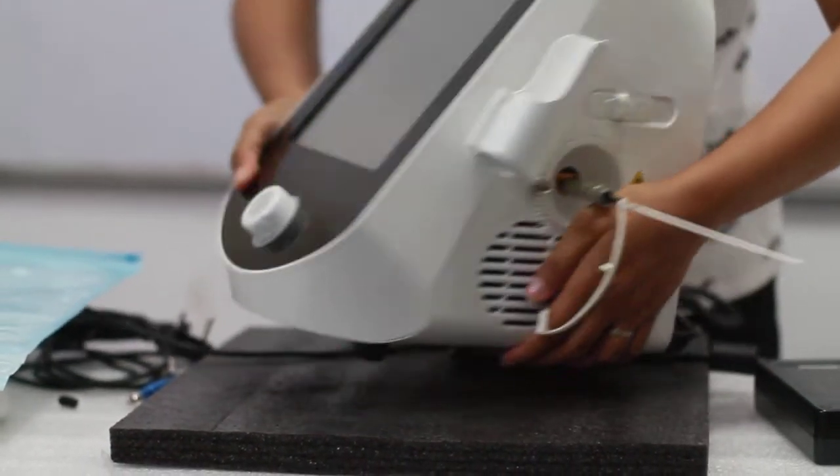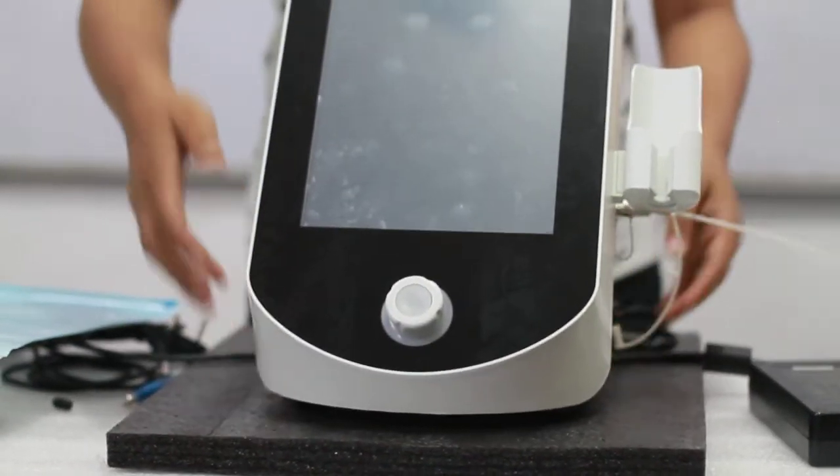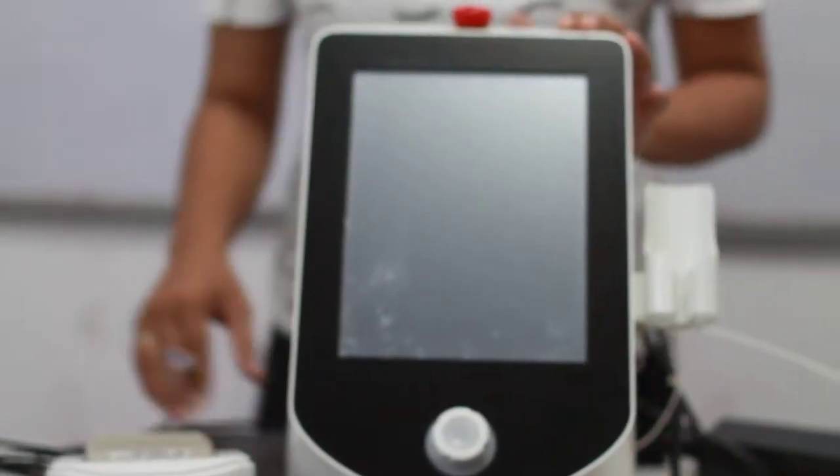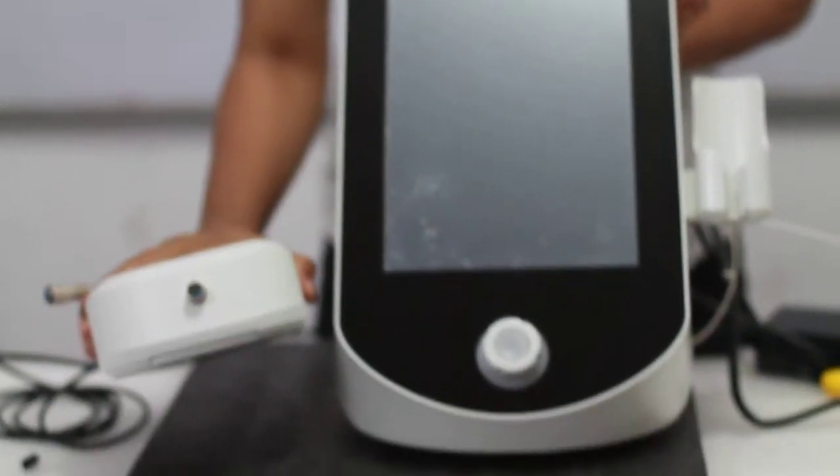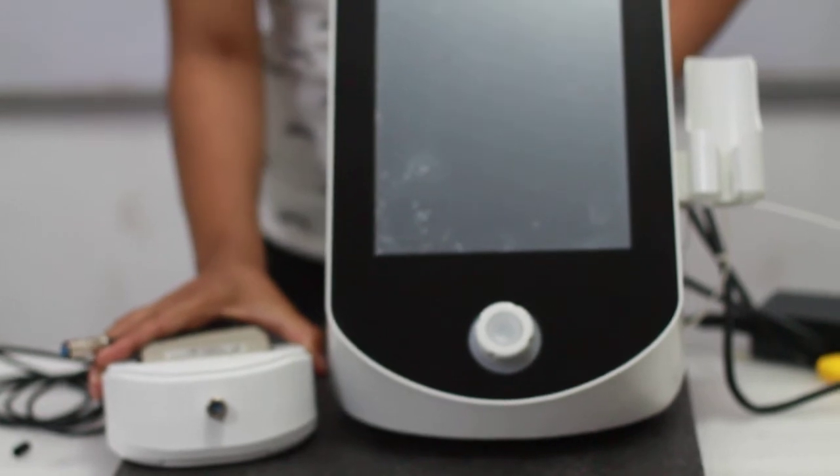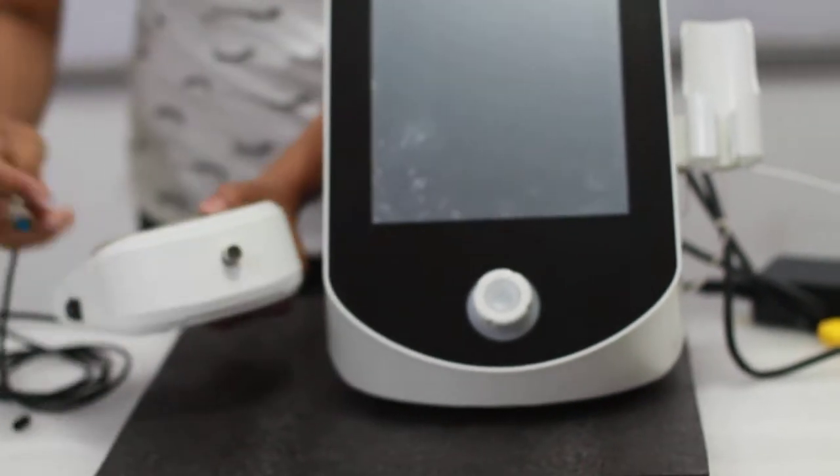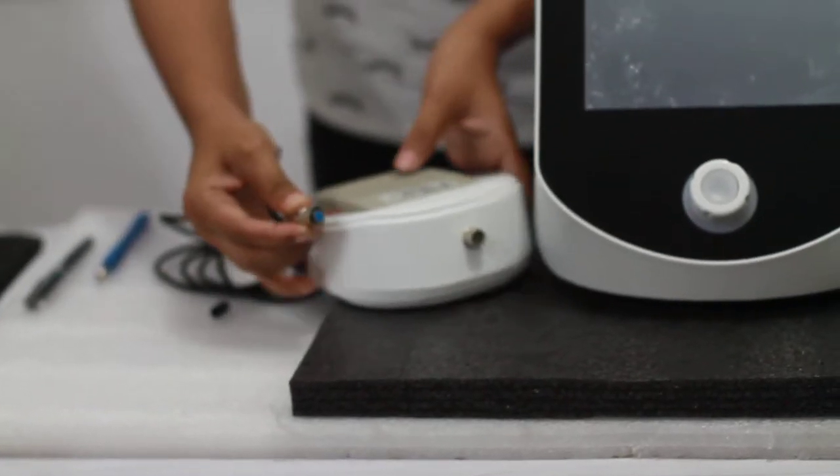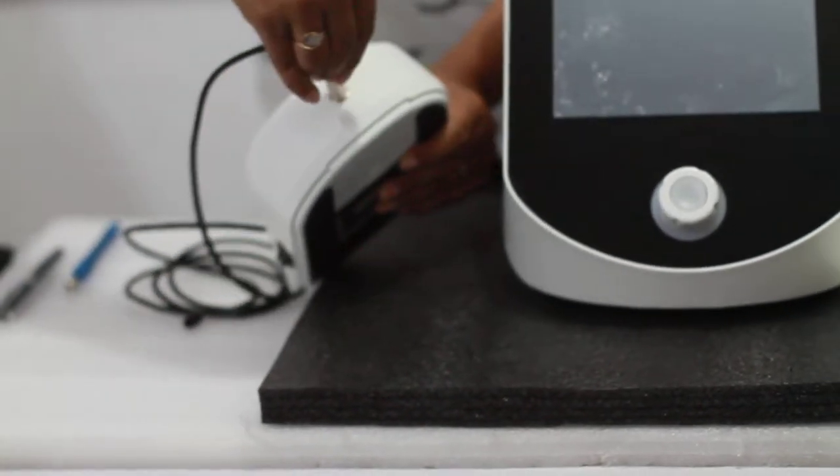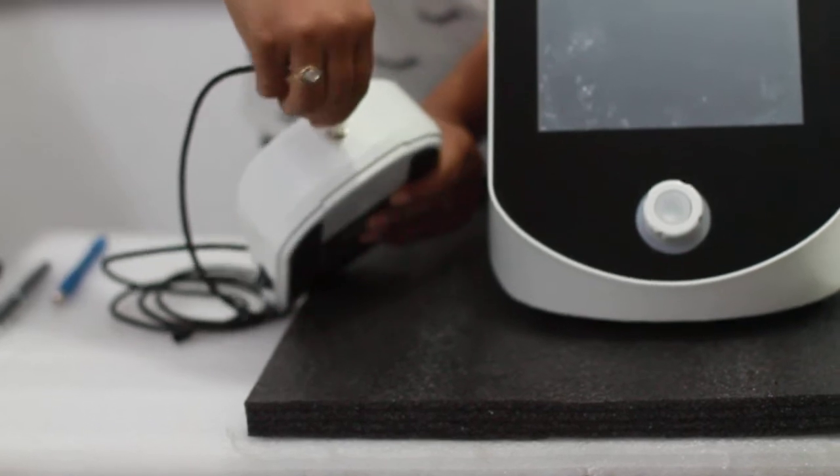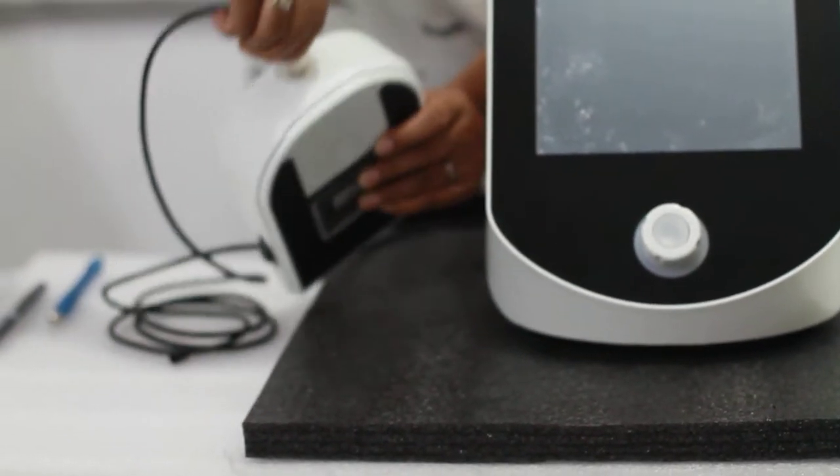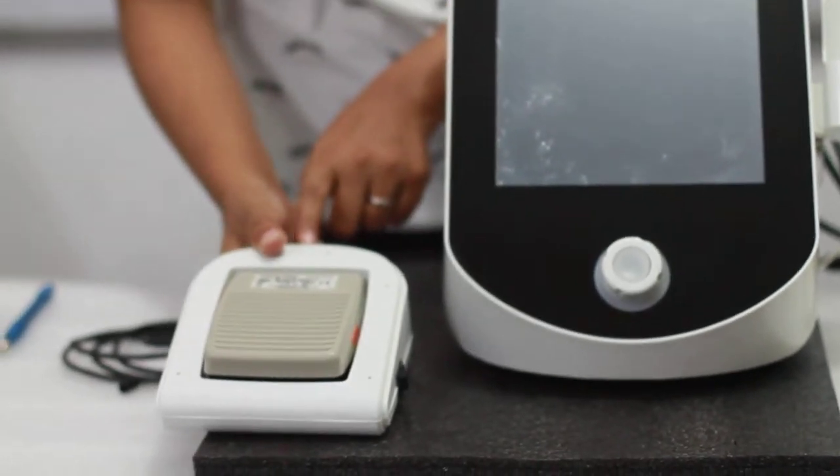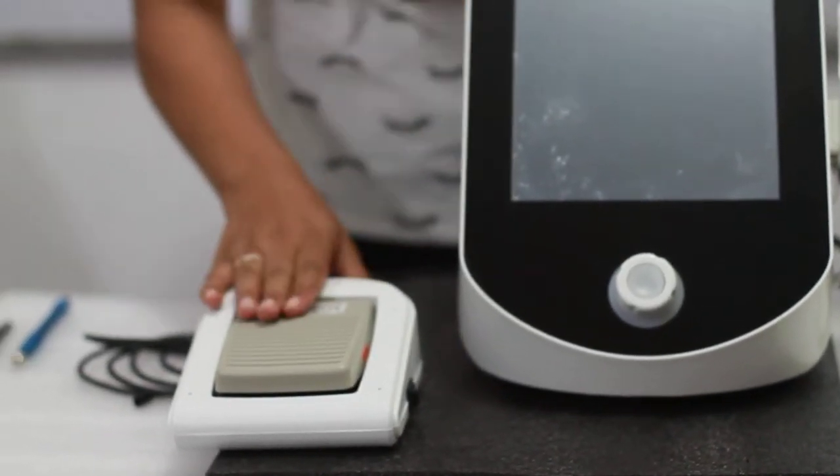Once this is connected, now we will check the machine. So this is your foot pedal. The other connector is already connected in the machine. Now what we have to do is, can you see this? Pull it backward. And once this sound comes, this click sound, that means your foot pedal is now connected.